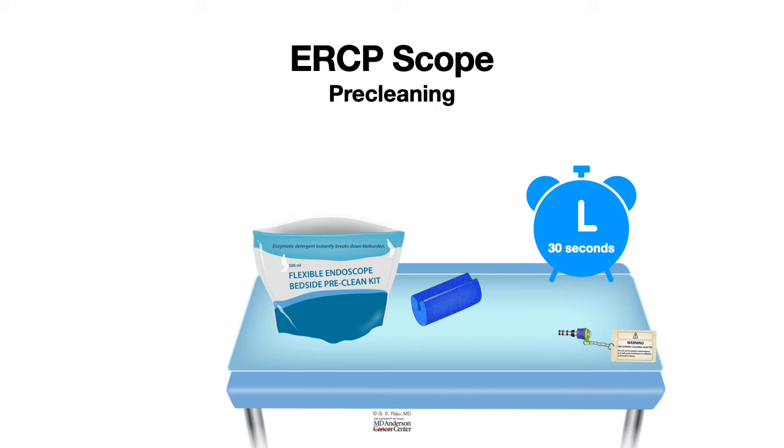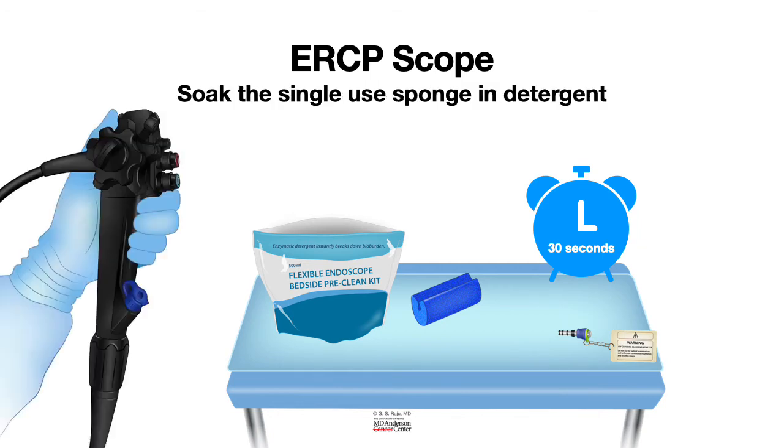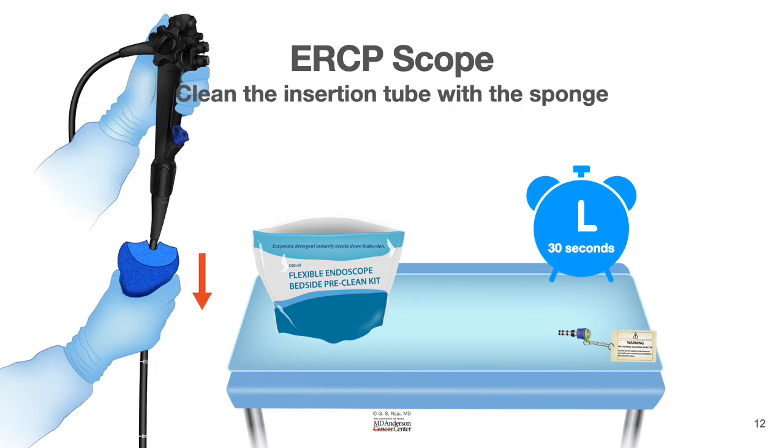So the first thing is you take the sponge and soak the single-use sponge in the detergent, and then clean the insertion tube from the top end to the tip until you remove all the contaminated material lying on the scope. So once you clean the outside of the scope, the next step is to clean the channels. Basically, there are three channels. One is the suction channel, second is air-water channel, and the third in the ERCP scope is the elevator channel.